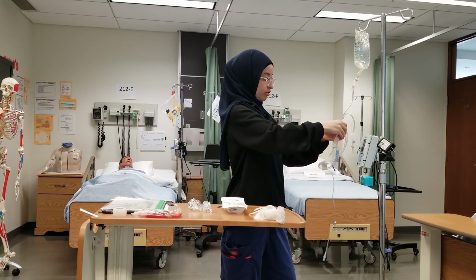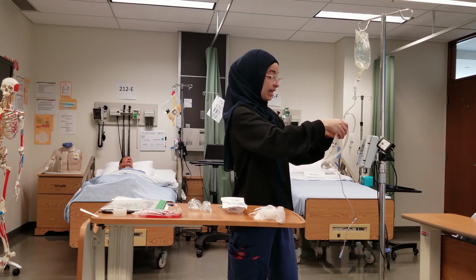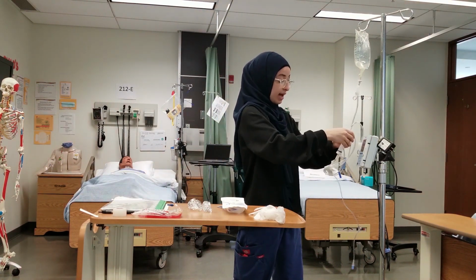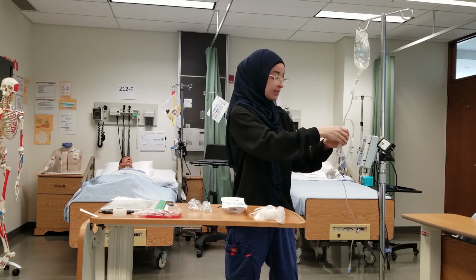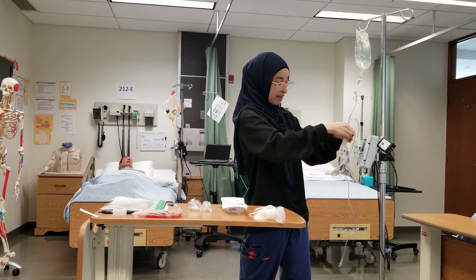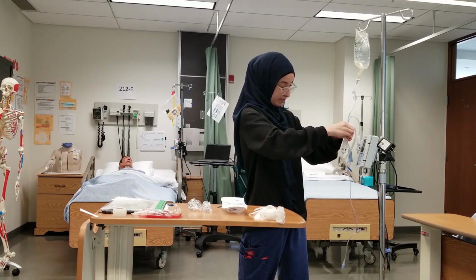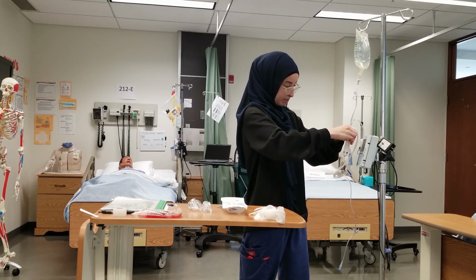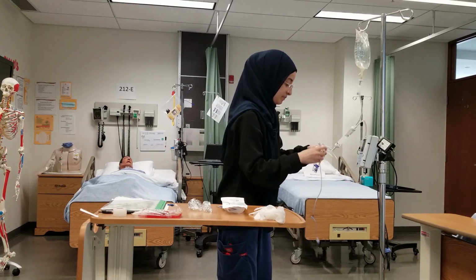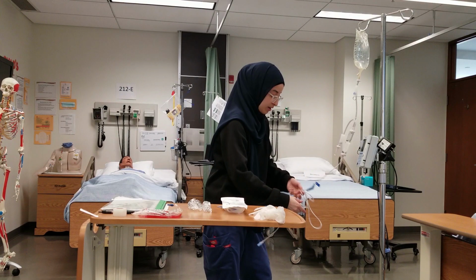So when we're pushing the normal saline into our drip chamber, we want to make sure that the filter is covered completely with normal saline. That way when we prime our blood later on, when it touches the filter, it won't hemolyze. That can happen if the filter isn't completely covered with normal saline. So we want to make sure that filter is completely covered. Perfect. And then I'm going to go ahead and prime the rest of my line. This will make it easier for the blood to move later and it won't stick to the edge.